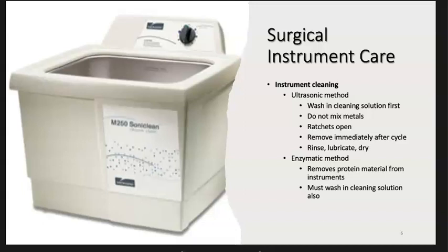The ultrasonic machine will also have to undergo maintenance and cleaning, as the debris from the instruments tends to settle towards the bottom of the ultrasonic machine. Usually they're used for a period of time, and then the solution is discarded and replaced.